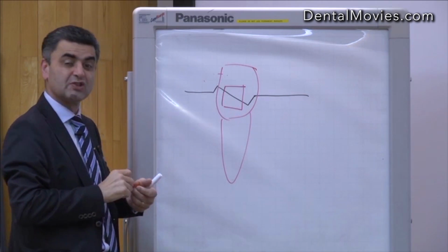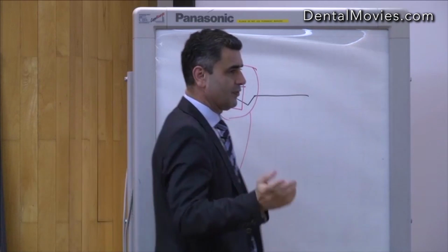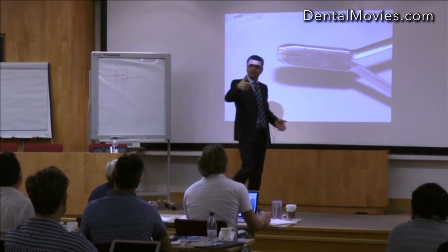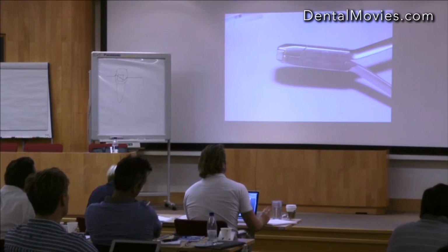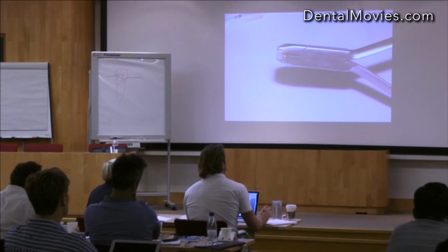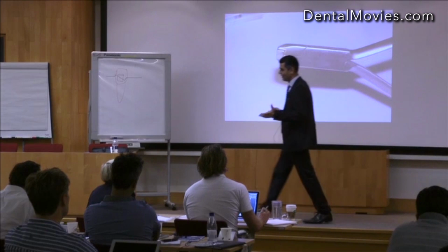Right? This is called a second order bend plier. Now thank God for you guys, because you're not good at wire bending, you can buy a plier that just goes crimp and does the second order bend for you. And guess what that plier is called? Second order bend plier, yeah, absolutely.